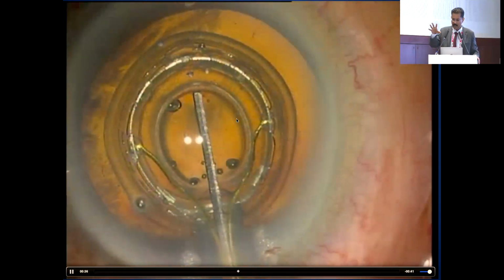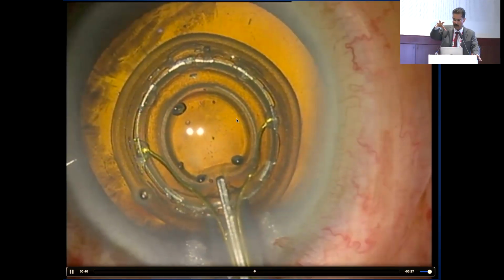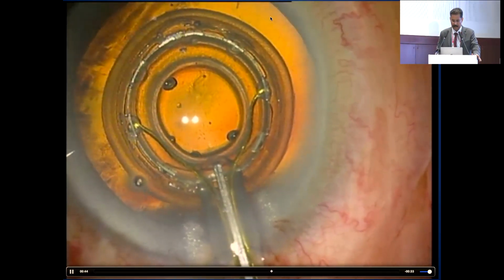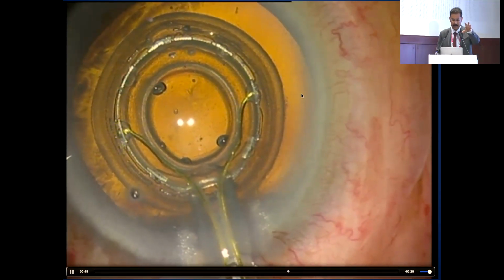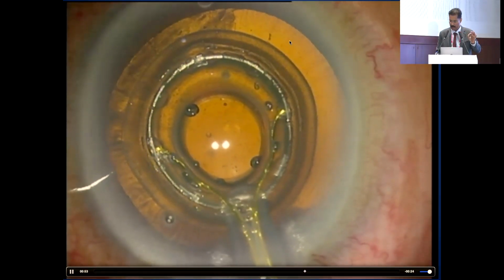And that can be placed on the center. And when we apply vacuum, this silicone ring holds onto the capsule. You can just see the edges of the capsule here. I'm trying to center it. And after that, see the edges, there will be some suction on the capsule. And you'll see some folds on the capsule which are forming because of the suction here.